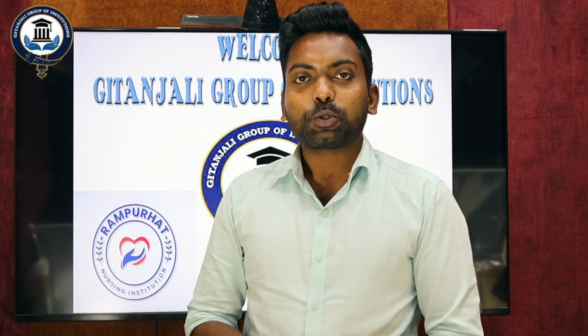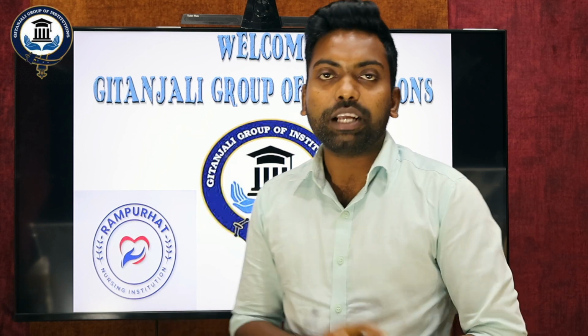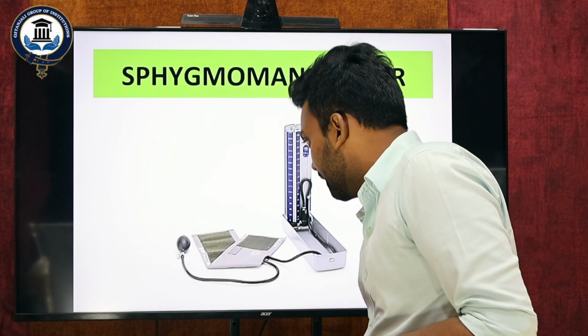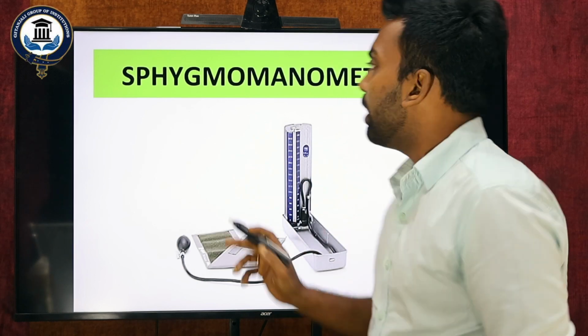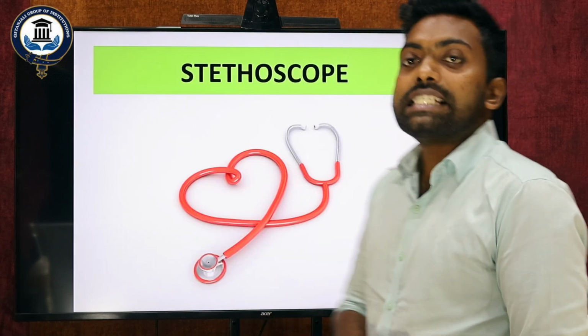My dear students, today's session we are going to discuss what are the articles needed for the measuring of blood pressure. Dear students, we have discussed in the past class what blood pressure is, how to measure blood pressure, and what the exact sites are. Today we are going to look at the articles for measuring blood pressure. The main tool which gives accurate data of measurement of blood pressure is nothing but the sphygmomanometer. So this is one tool, and the second one is a stethoscope.